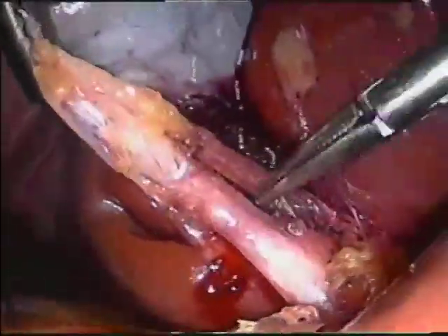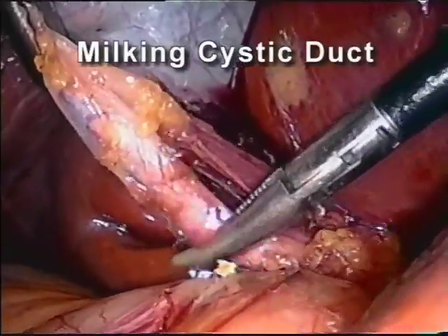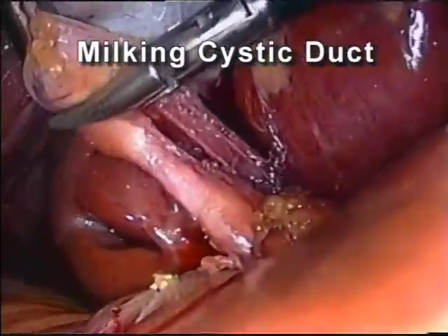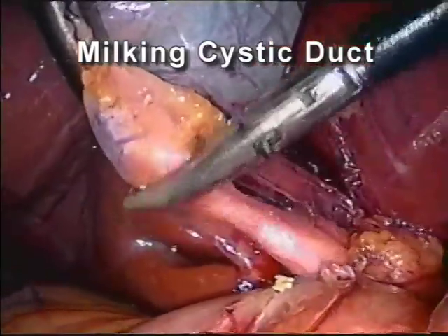When the dissection has been completed, the cystic duct is compressed serially towards the gallbladder in a milking fashion. This will help eliminate mucus, sludge, or tiny stones from the cystic duct and enhance cystic duct patency.